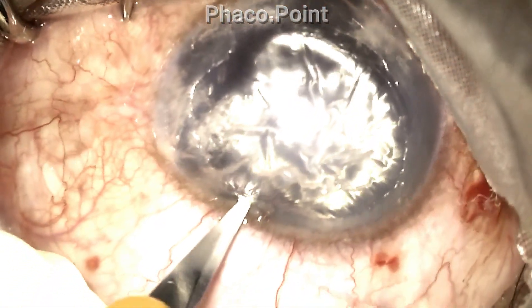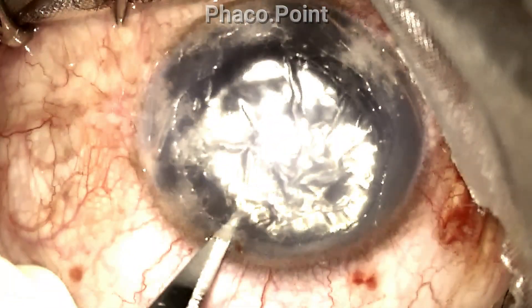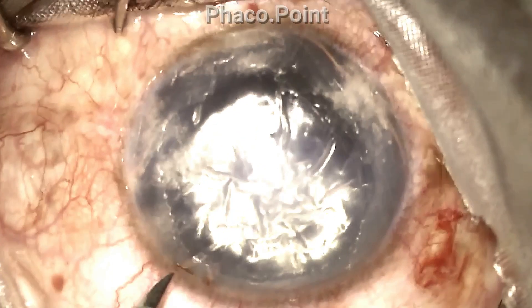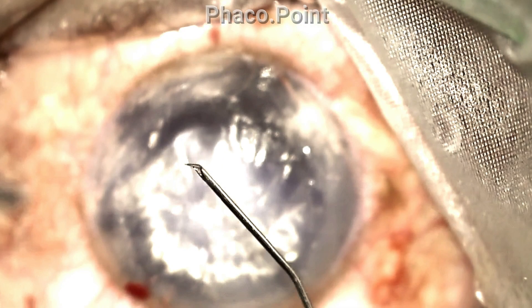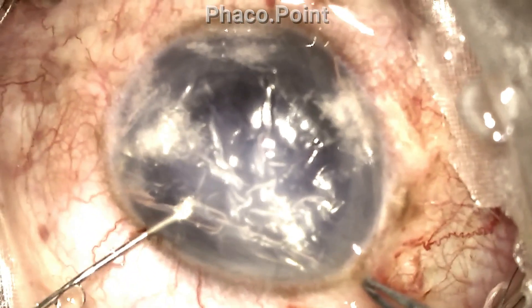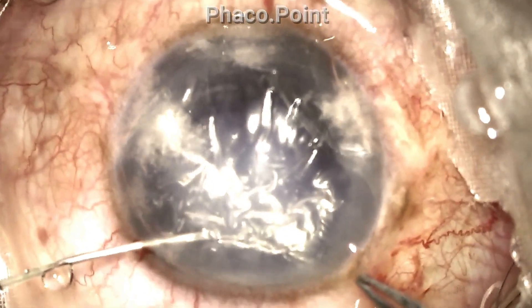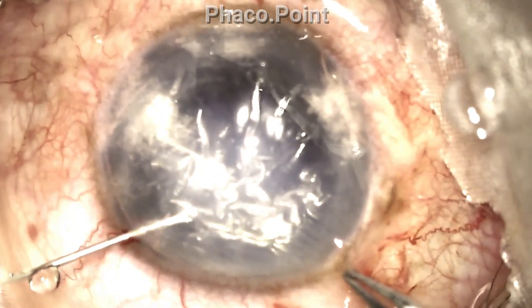In order to do so, I make a paracentesis incision superiorly. The paracentesis incision is made with great care and caution, ensuring that I do not lose any gas from within the anterior chamber whilst doing so. A 30-gauge needle is bent in the manner demonstrated here. Please note how I introduce that bent tip into the eye and pull in the folds in an attempt to flatten them — however, I am unable to achieve a complete flattening of the folds.